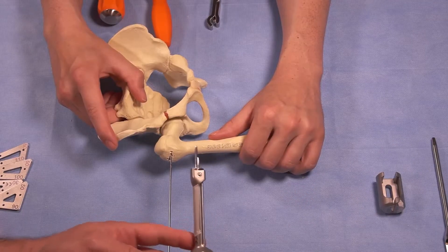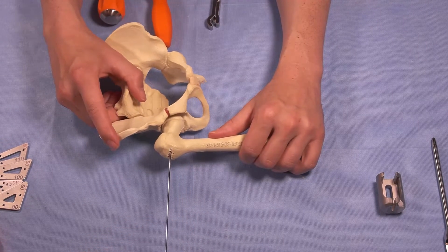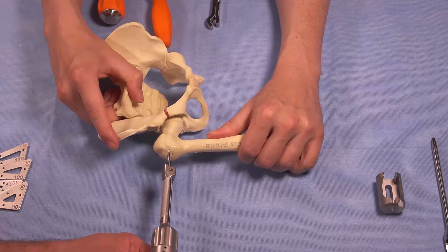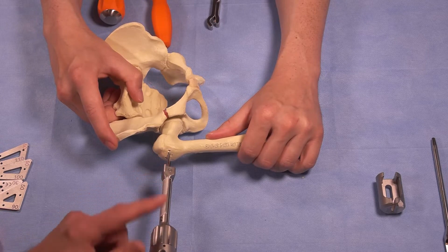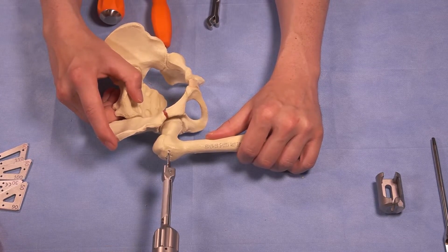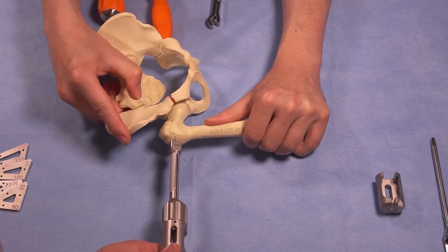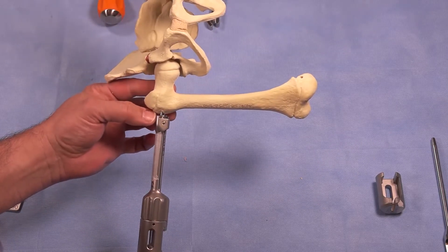Now we're going to place the chisel blade using the extension handle into the bone down the guide wire. The guide wire is in the 1-1 position, so the chisel blade is going to follow that wire. You follow this under fluoroscopy. With sawbones, I would advise insertion and drilling, but in real life this is the beauty of this system — as you place it over the guide wire, you hit it in once and you're done. No back and out, no malleting with a chisel. I take the mallet and drive it, leaving it just slightly proud. The plate is not quite flush yet — you want to leave a little bit of room to put your final plate on, then do your final impaction.